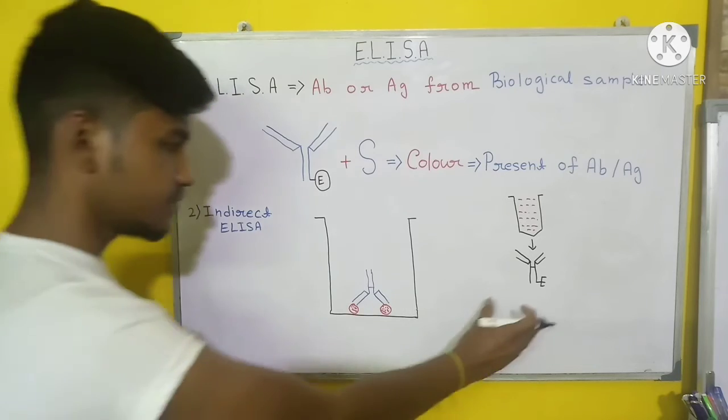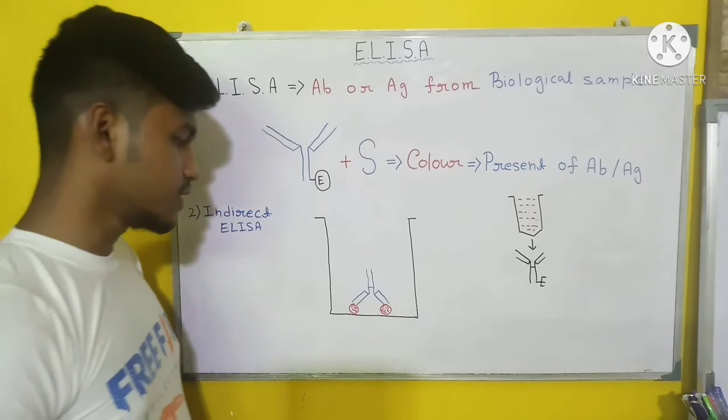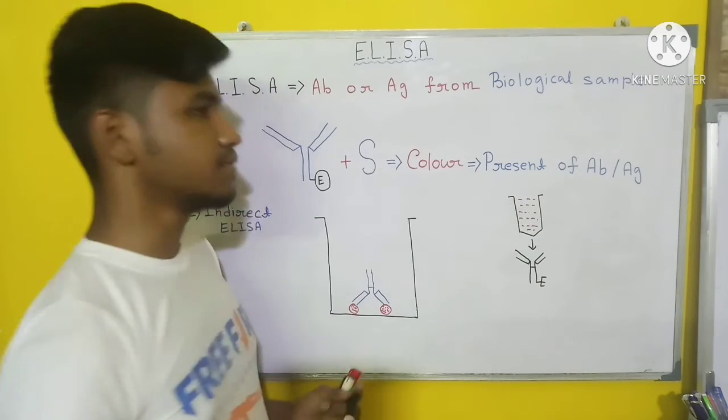This enzyme linked antibody is specially designed in the lab to detect the antibody from the patient serum sample.